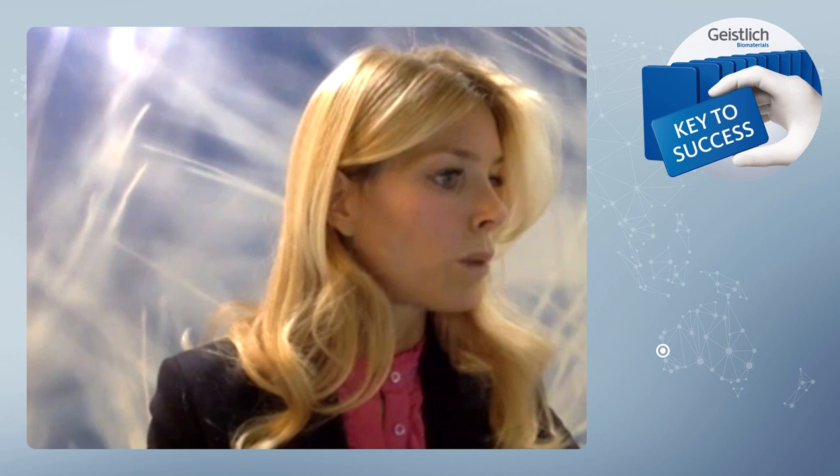Okay, what is the management for vertical releasing incision in the highly aesthetic areas? Have you seen a need for scar revision? Absolutely not. If the incision is performed correctly, then there are almost never scars. I tend to release vertically distally to the canines. This is for obvious reasons. So I am not scared of elevating a larger flap when everything is maintained and there is no disease, of course, which implies that you're doing GBR. So definitely distal to the canines if you have to do it.